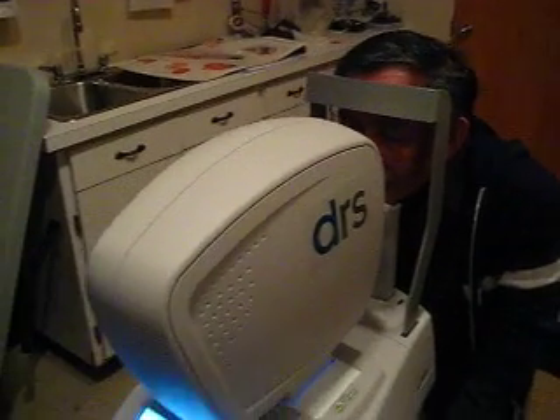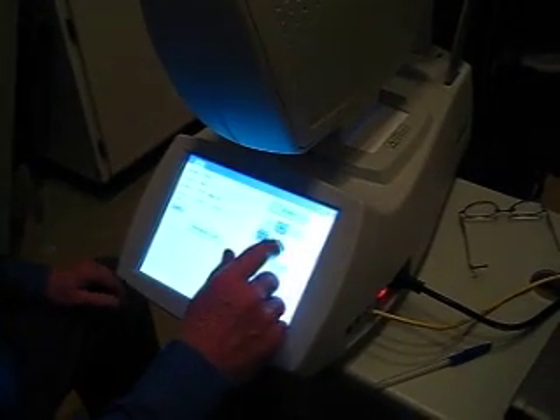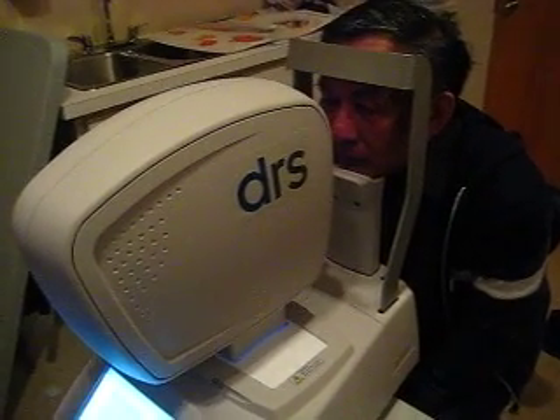I'm going to sit down here. Please push down with your chin so you can hear the click — like that. I need the pressure like that. That's perfect. I'm going to take now your image. The camera is going to begin to start to look for the center of your eye.